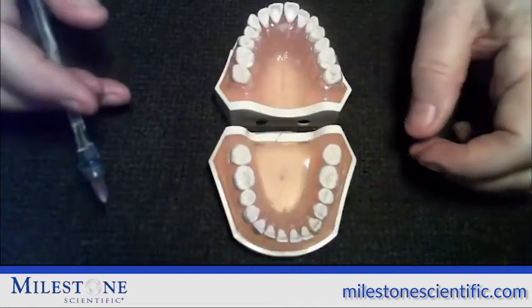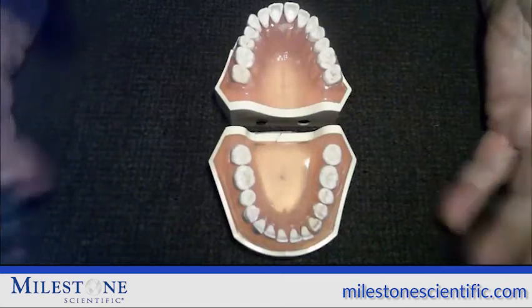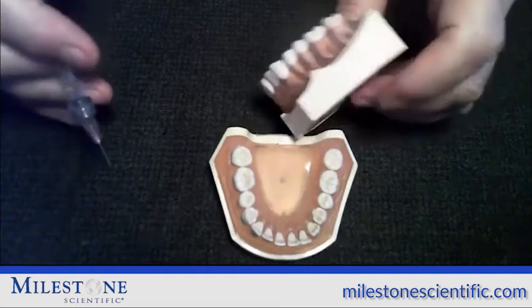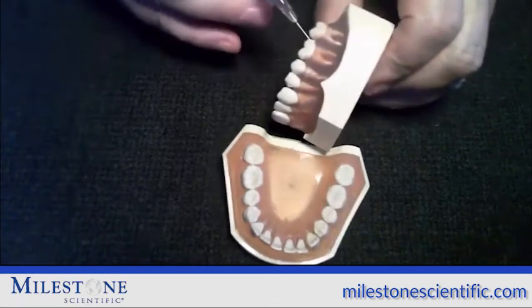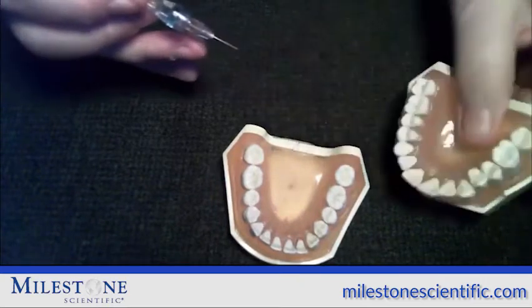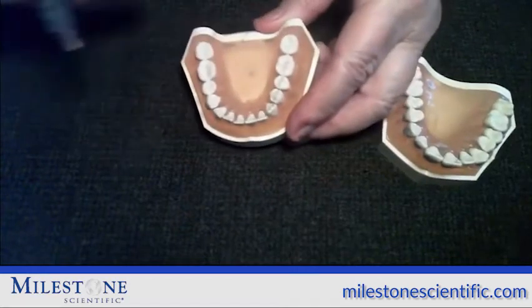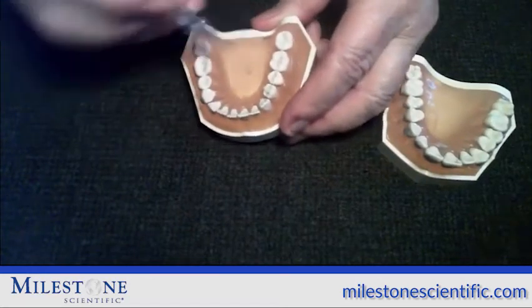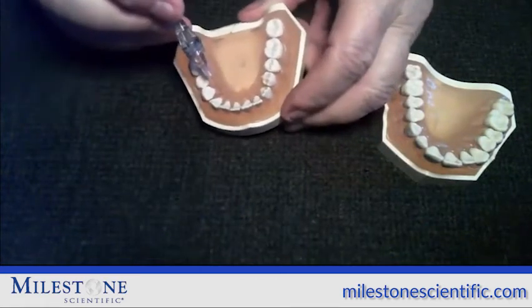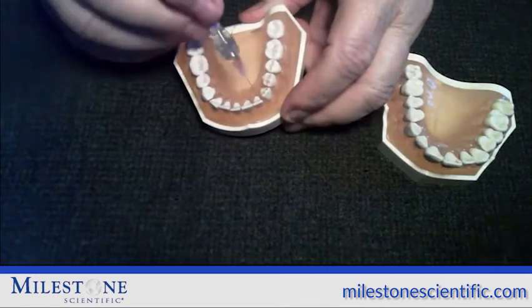The intraligamentary injection is a very useful injection for anesthetizing any tooth or multiple teeth. Maxillary teeth have two injection sites, the distal buccal and then the mesial buccal. On the lower teeth, we go to the lingual. So on lower teeth, the injection sites are the distal lingual and then the mesial lingual. On lower anterior teeth that have short roots, only one site is needed, usually the distal lingual of these four incisors.